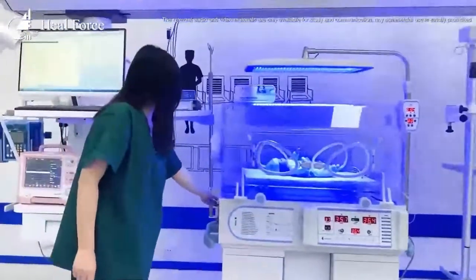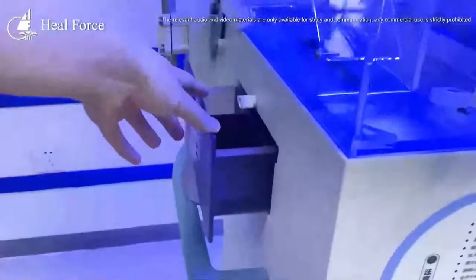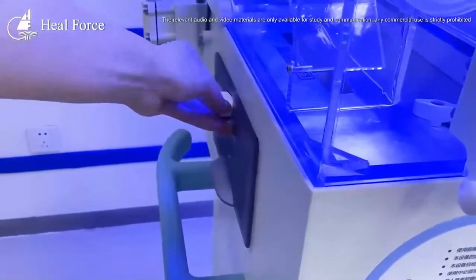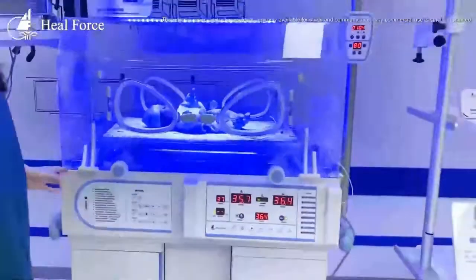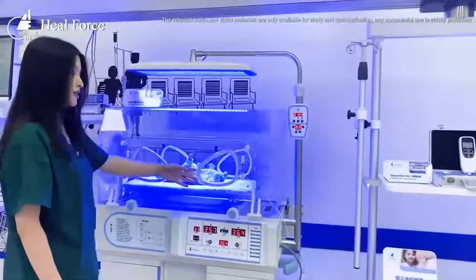This is our water tank — it is lockable. We put water in and the water is vaporized by the heating element. Then the air gets inside the incubator, providing the humidity and temperature for the baby.